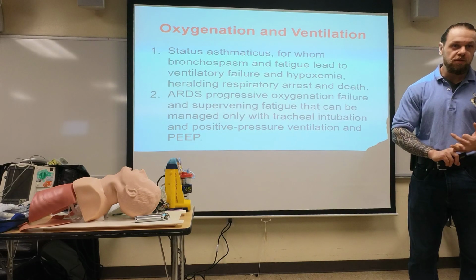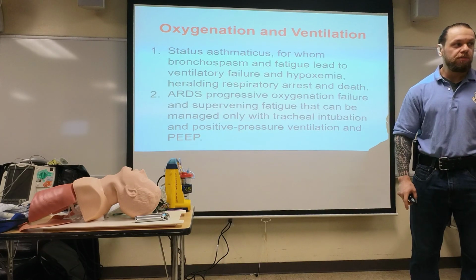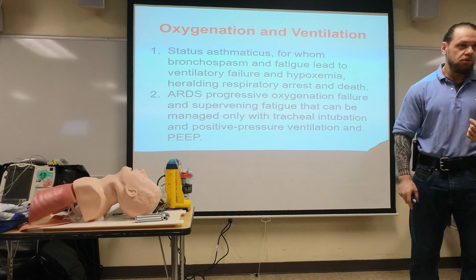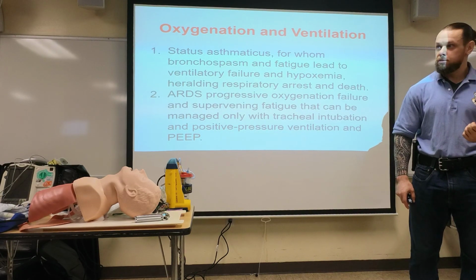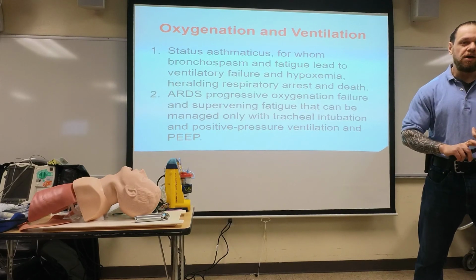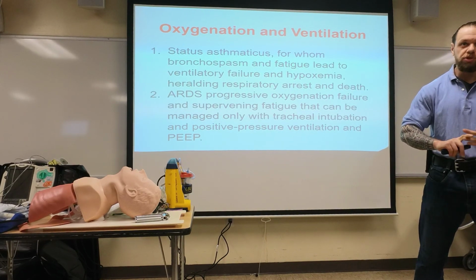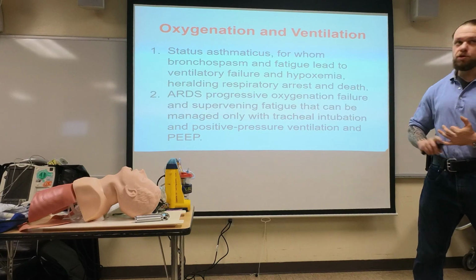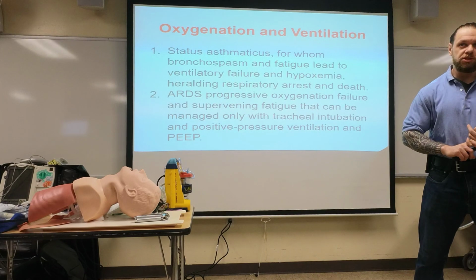So we're intubating them not for any of the first two. We're intubating for choice number 3. Who can give me an example of a patient like that? You go to a facility, and you have a patient who doesn't have a problem maintaining or protecting the airway. Currently, let's say they're on CPAP or BiPAP, and they don't have problems with oxygenation and ventilation, their pulse ox is good, but you anticipate their clinical course is to decline. So you say, we want to intubate them. Give me an example of a patient like that.